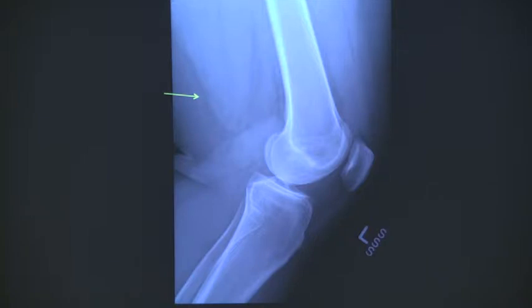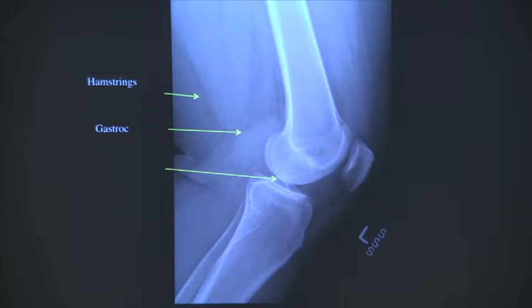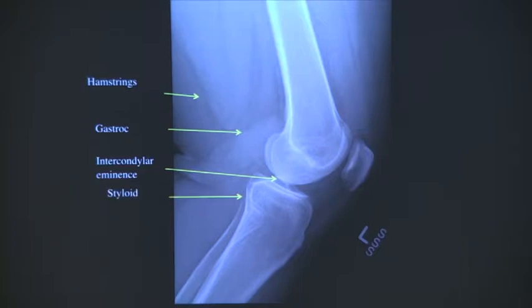Semitendinosus and gracilis. And biceps femoris. Very good. So those are the hamstrings. And these are the conjoined tendons. Very good. I think I am pointing to the intercondylar eminence, the styloid, the fibular head.